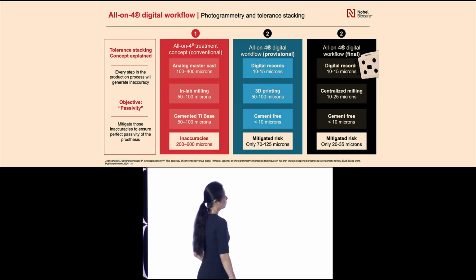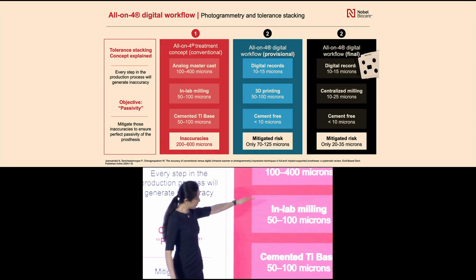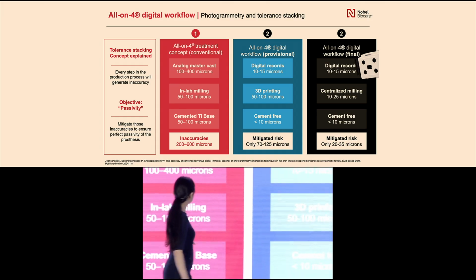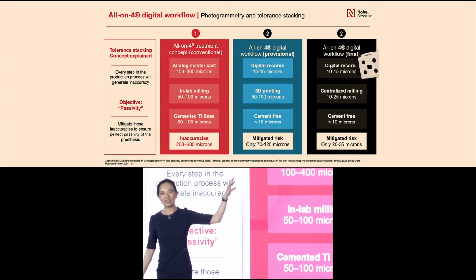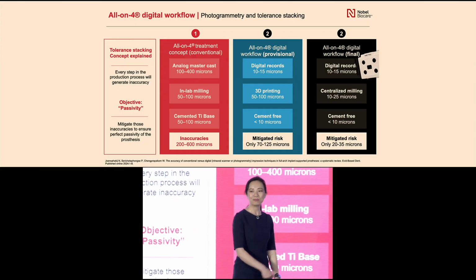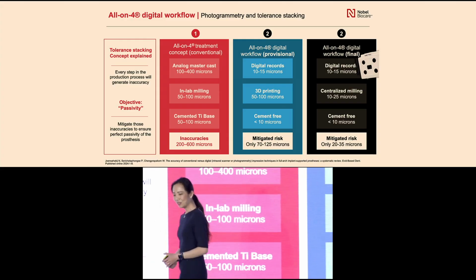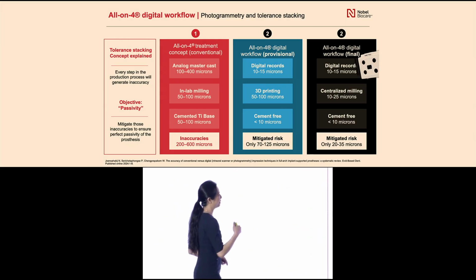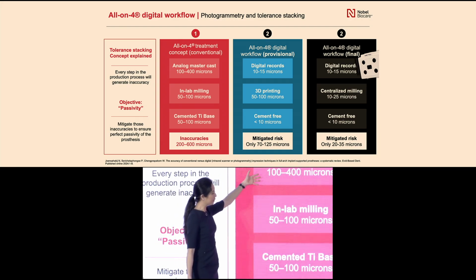So if you were to look at just fabricating an all-on-4 type prosthesis, this is the cumulative errors that can occur over time. What you'll see is that even if you had the perfect impression poured, what if your technician was really ham-handed and didn't make sure all the analogs were seated, or maybe they're really upset at you and poured up the stone and just slammed it onto the bench top? Will that move your components or change your impression even if the PVS is perfect? Totally, right? Or what if they decided that they wanted to pour it in Die-Keen, which is a type 5, or not type 5, but a very large expansion stone? What will happen there? So when you look at the master cast, there's a lot of variation.